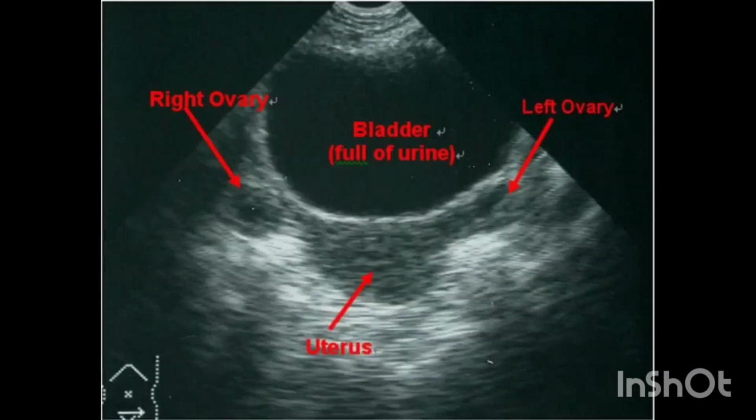Follow our next study on the ovaries, adnexa, and fallopian tubes. Then we continue with identification of pathologies.